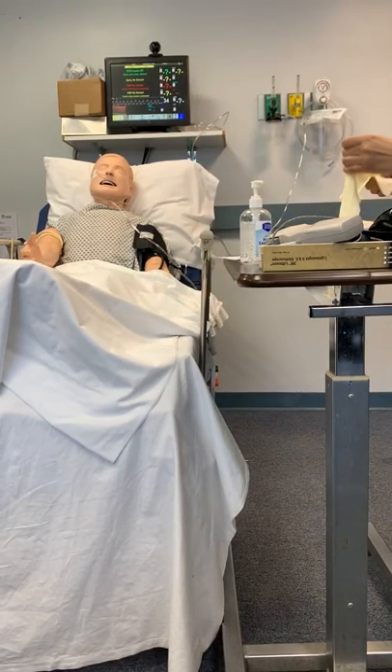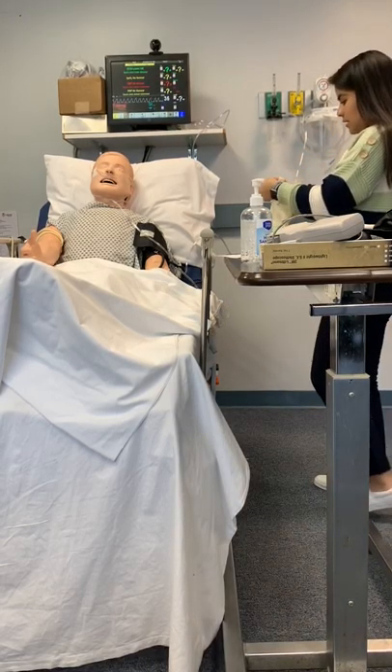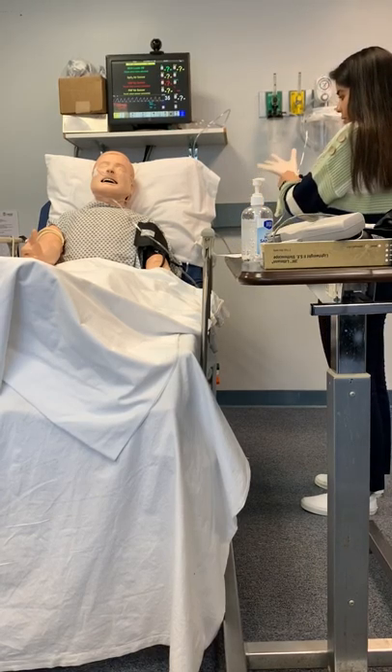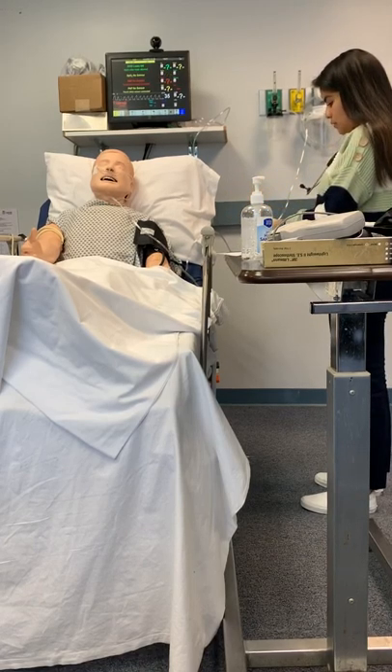I don't feel well. You don't feel well? What's going on today? I feel like I could die. Okay, well, hopefully you don't. We'll get something figured out. I'm going to listen to your breath sounds, okay?